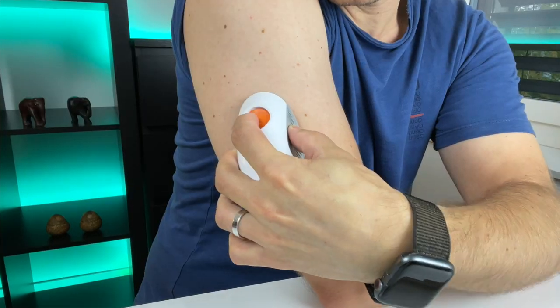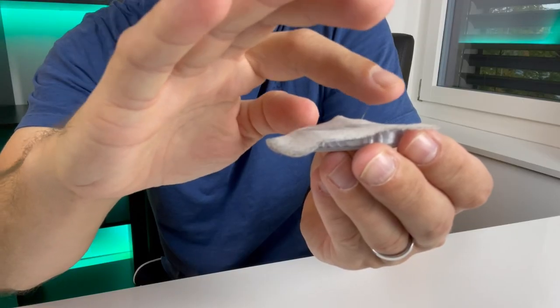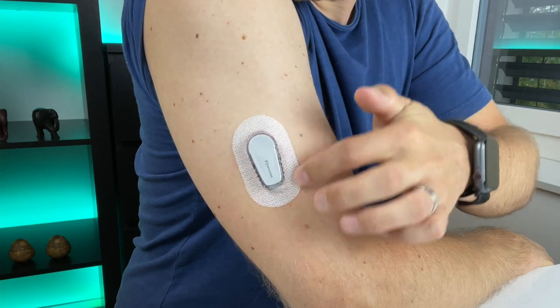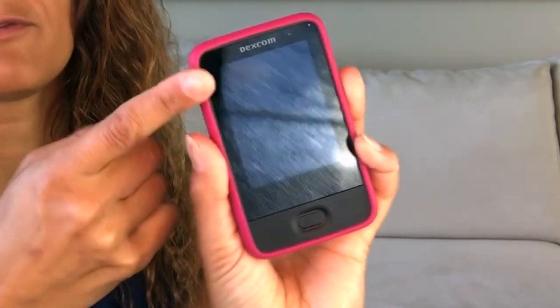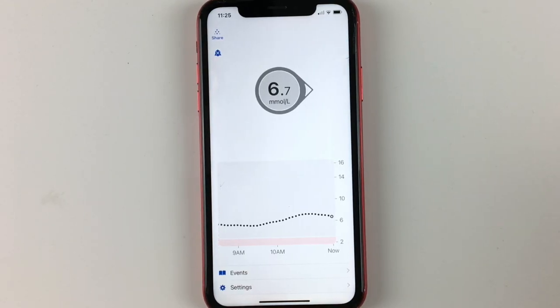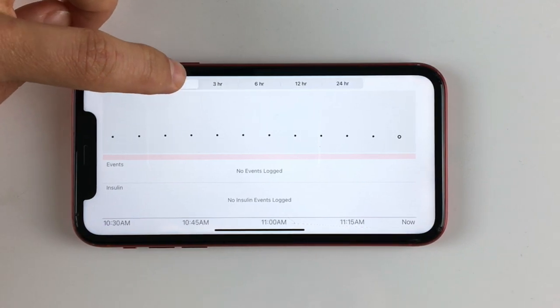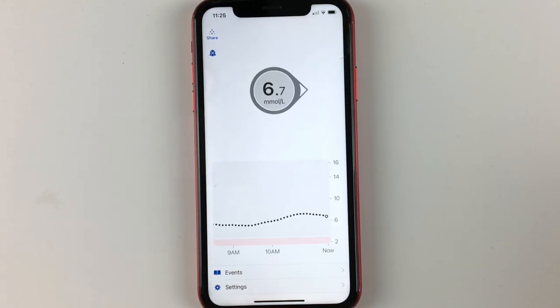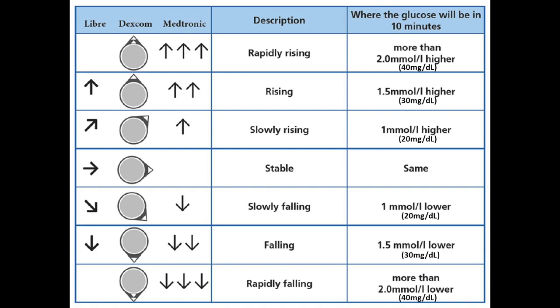Dexcom G6 is a continuous glucose monitor, aka CGM, and it works like this. You place the G6 patch, which consists of a sensor and a transmitter, on your abdomen or arm. The sensor has a tiny filament placed under your skin that reads your glucose levels. The transmitter automatically feeds data from the sensor to your mobile phone or Dexcom reader via Bluetooth every five minutes, as long as the receiving device is within a six-meter distance. On the screen you will see your current glucose, a daily graph showing trends over the past few hours, and a trend arrow telling you where your glucose is headed — giving you a good prediction of where your glucose will be in the near future.